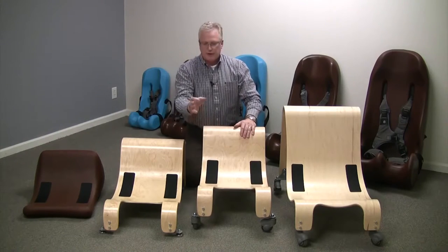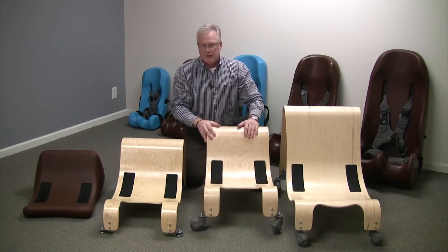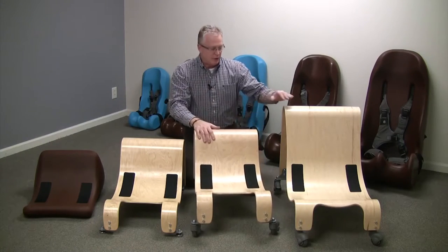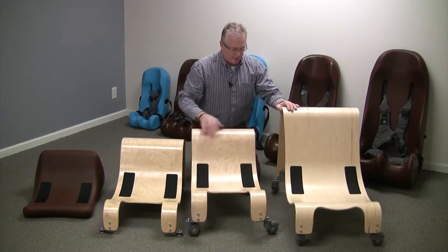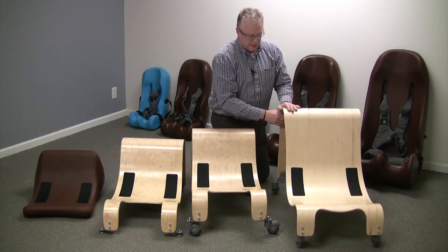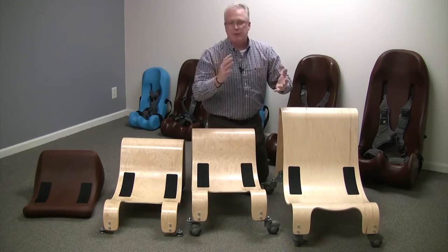This is to prevent the wheels, when they spin, from rolling over the client's toes. The large has the offset casters as well, however they're on the rear, and this prevents the product from becoming tippy.